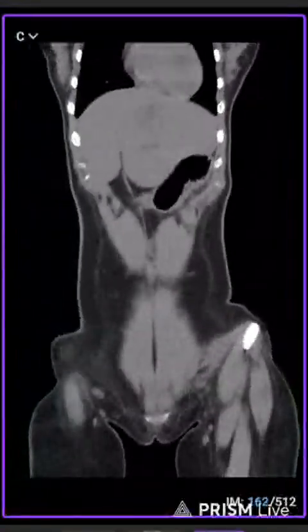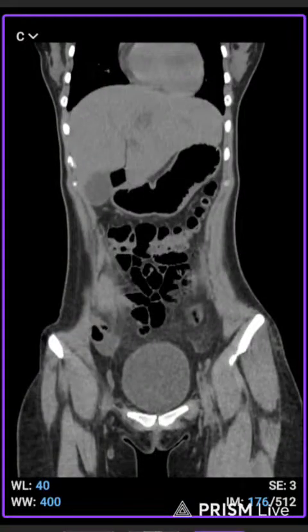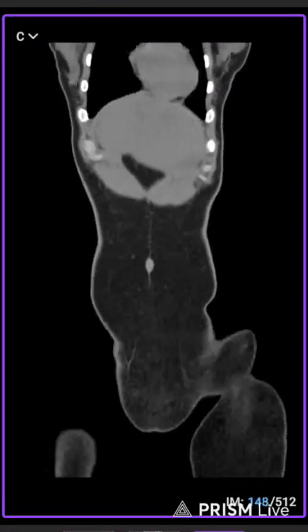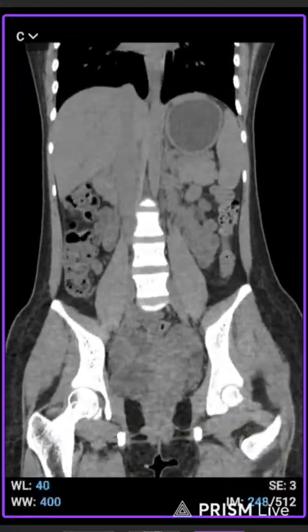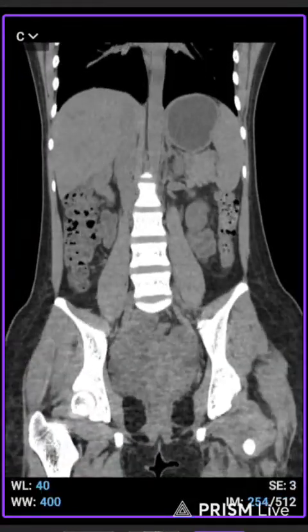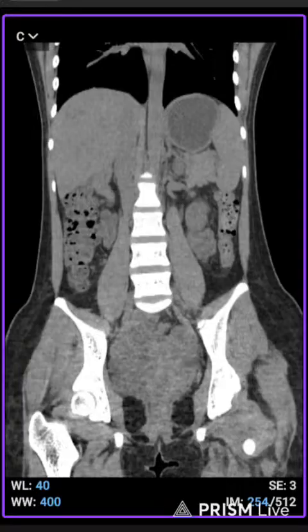In this scan we see a hypodense lesion in the liver, so we prepare for a triphasic scan. If the doctor only wants a normal contrast abdomen scan, we do that to diagnose the problem. Now after the plain scan we prepare for triphasic.